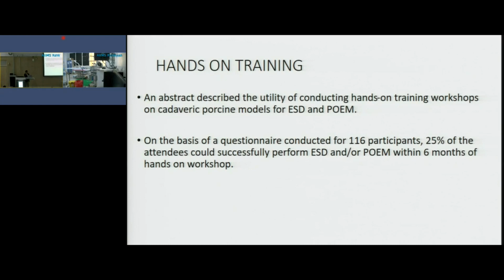After doing that, around 25% of the doctors were able to start their own cases. So you get the idea, though you don't have this bleeding and all in these models of course, you get an idea of the depth, the perception, how much to cut, how to use the accessories. So it's very important. Before starting on patients, the hands-on training on animal models is very important.